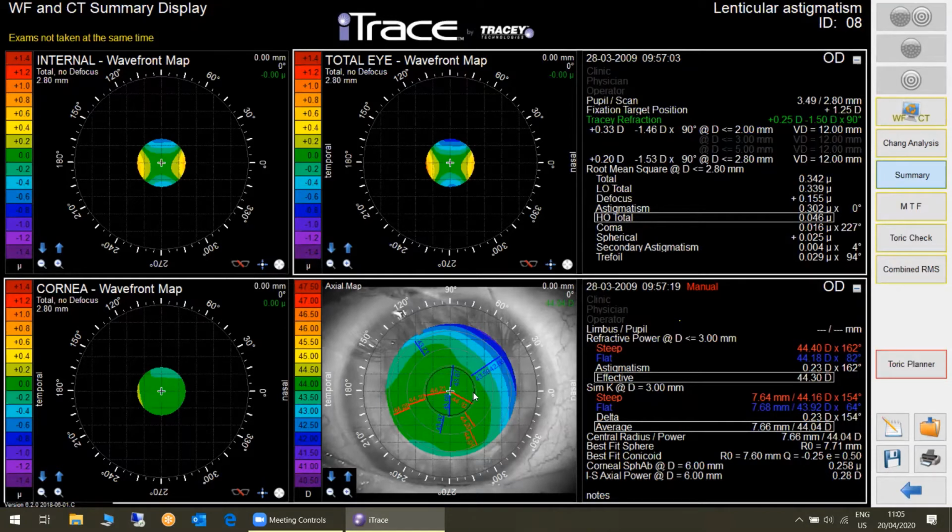Well, then I think the lens companies will be very happy to hear this. This is good for Barrett and toric calculators and the companies, but this is true, yes, this is from the field. Indication we need to perform to have better results in this case. But okay, go on.